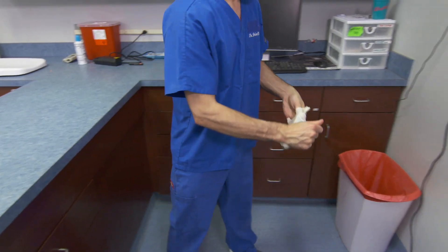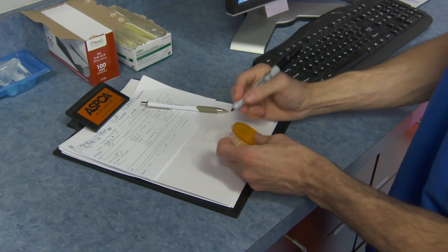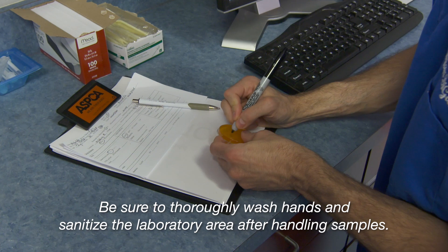Discard examination gloves, and label the plate with the animal's ID number and the date of collection.